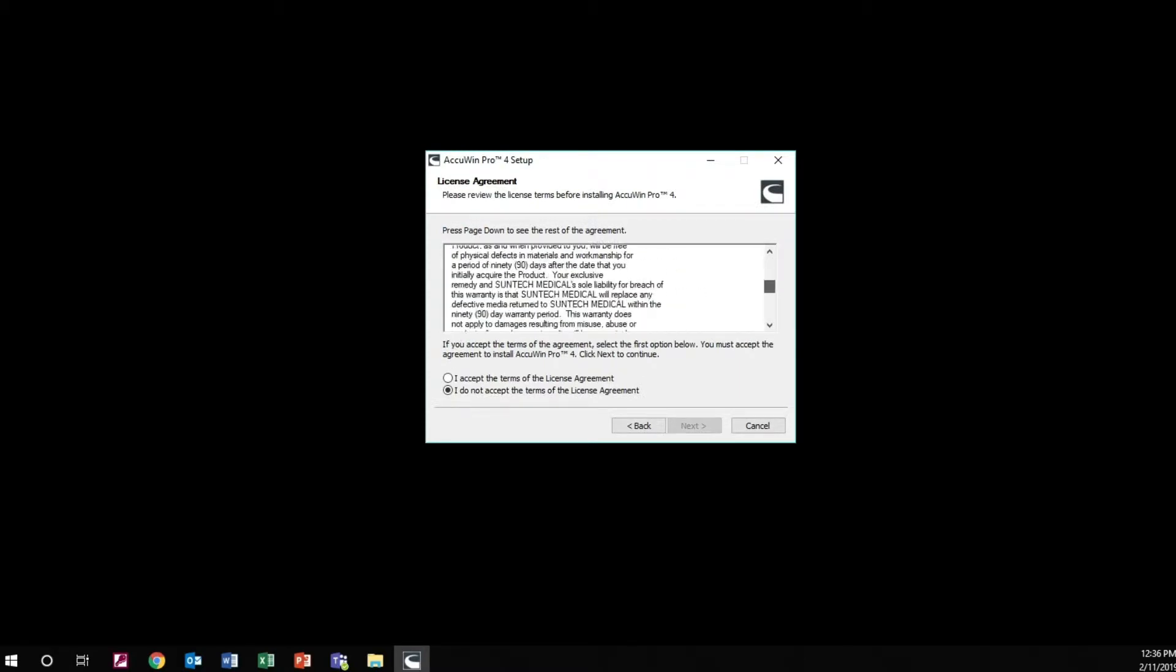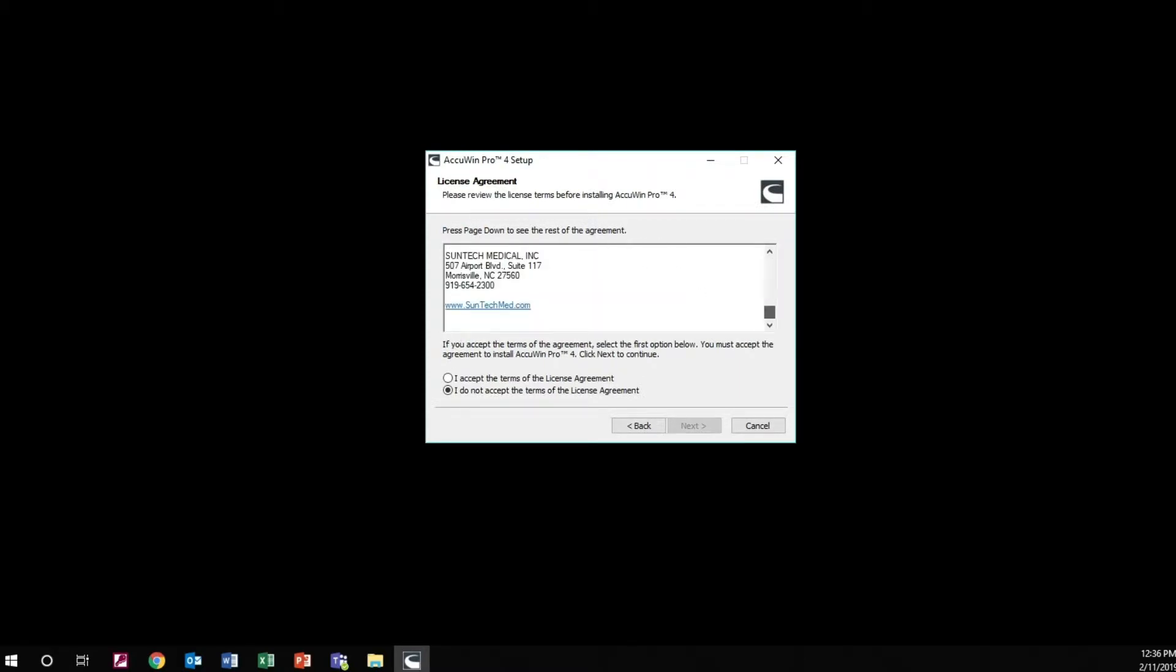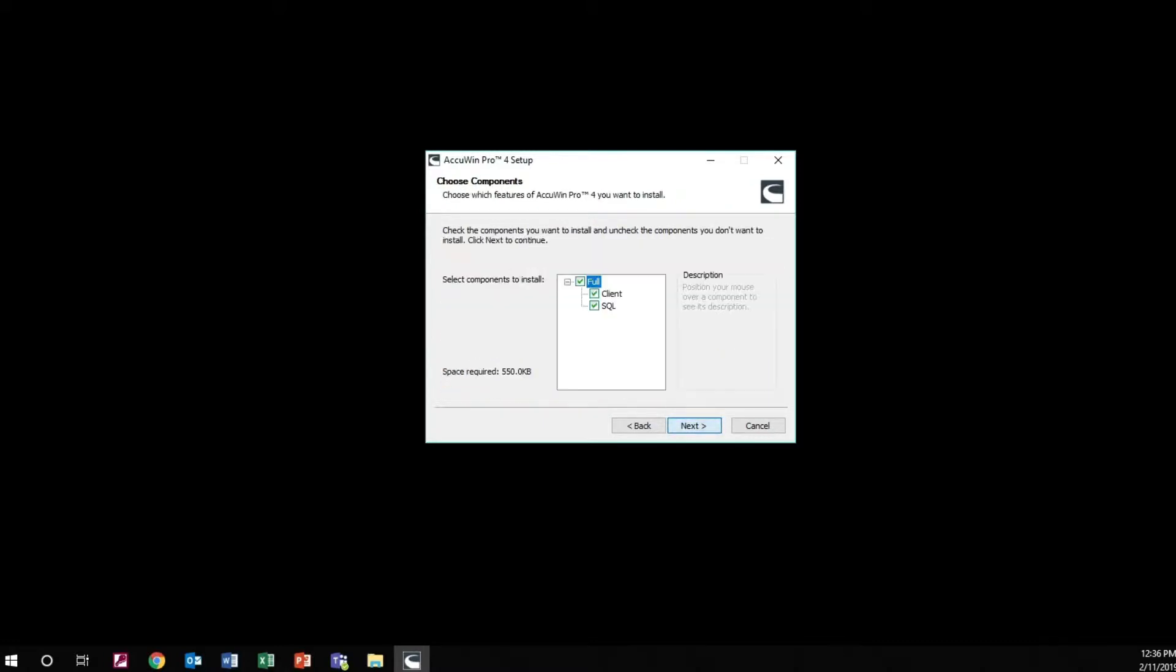Read and accept the licensing terms before you continue the AccuWin Pro installation. Select Next.